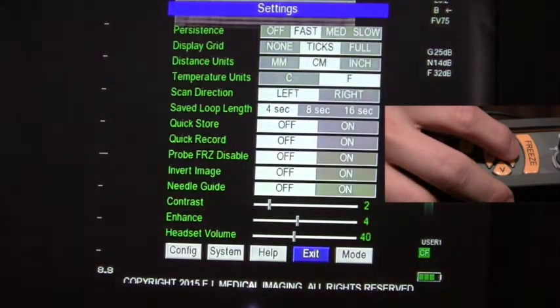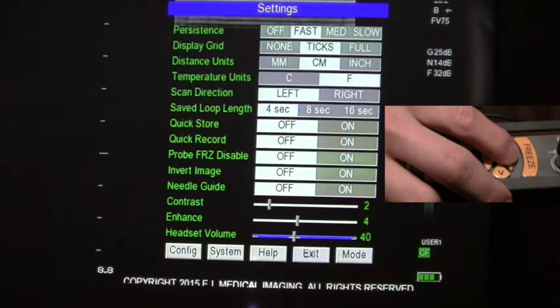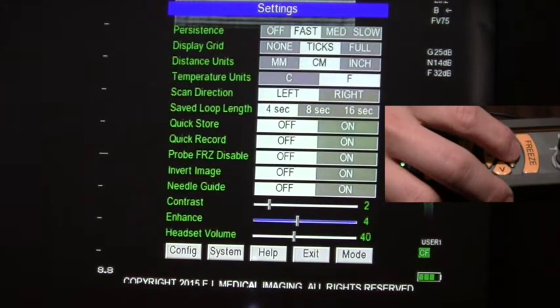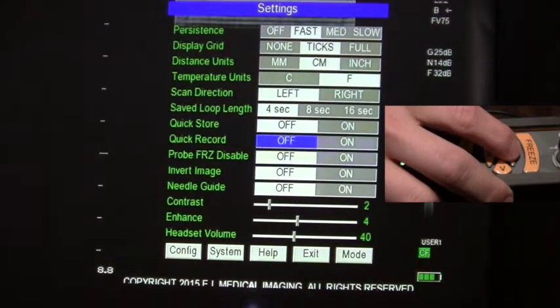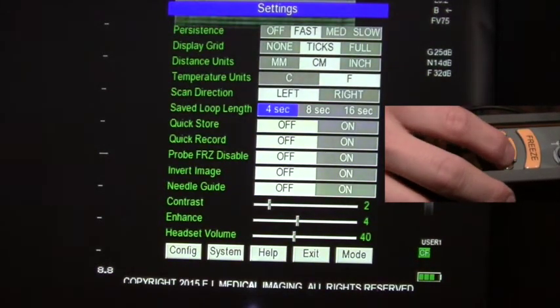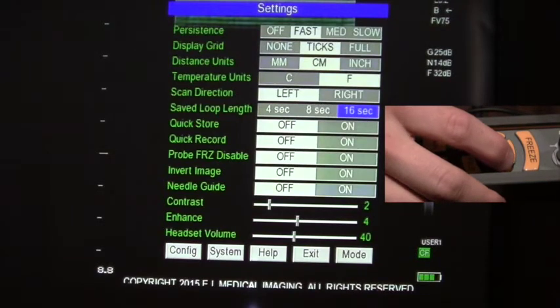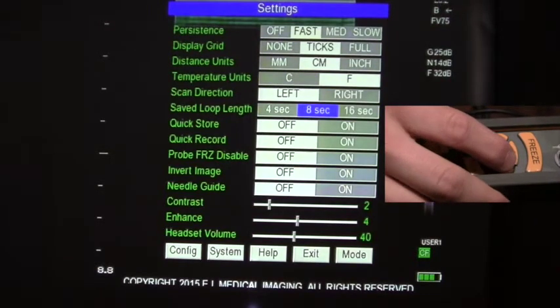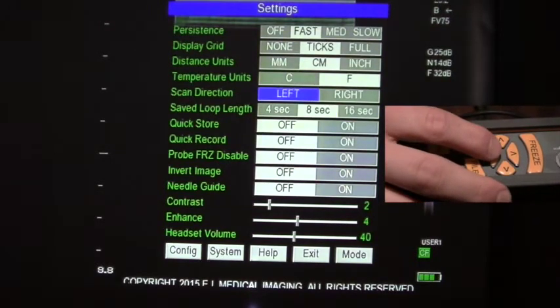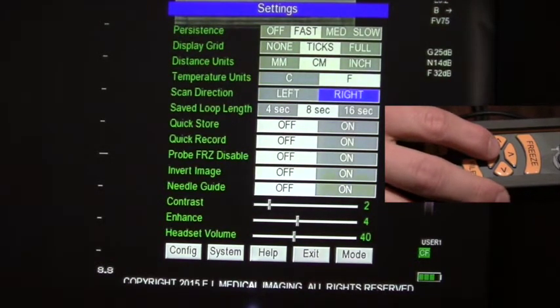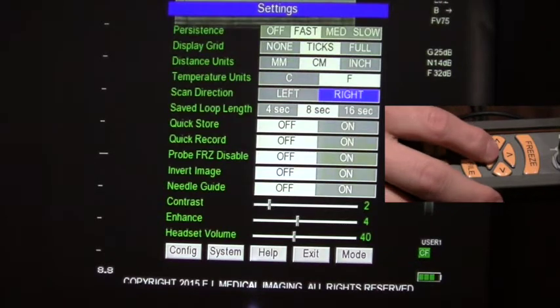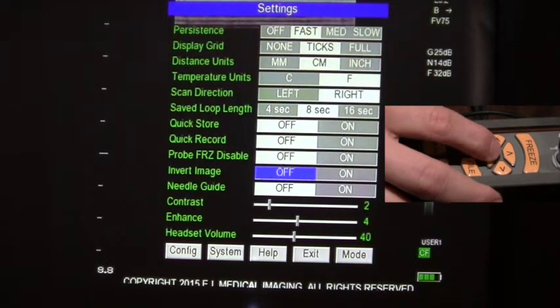Use your up and down arrow keys to select the setting you would like to change. Hit right or left to highlight the option you would like to change. When all your settings have been adjusted, scroll down to the exit key.